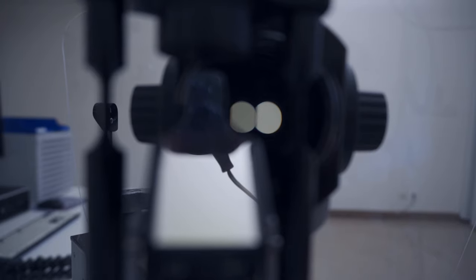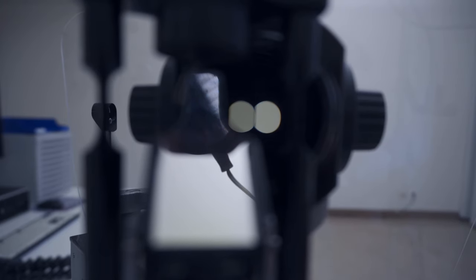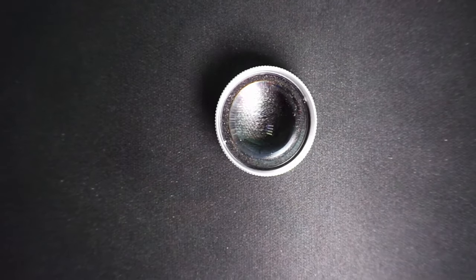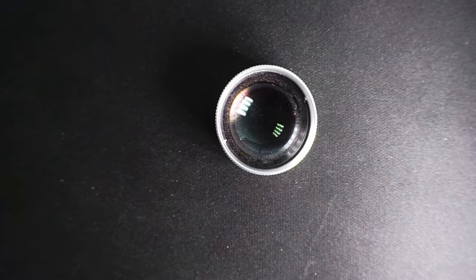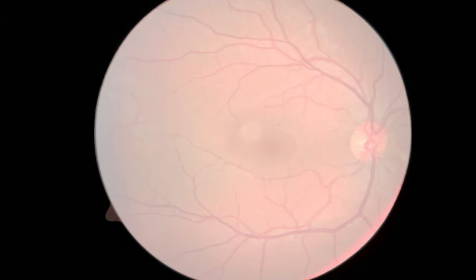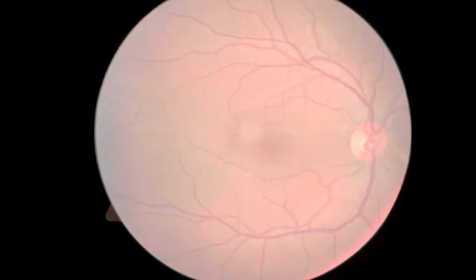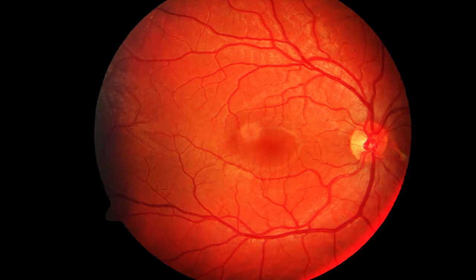Moving the mirror to the side comes with two more benefits. First of all, it reduces the reflection coming off of your lens. And second of all, it's giving your image more contrast.